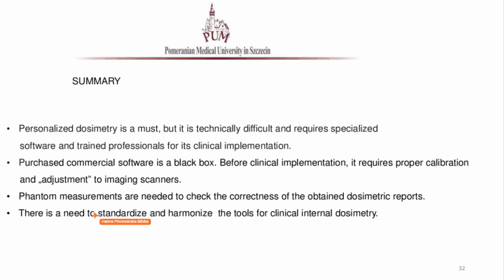Before clinical implementation, it requires proper calibration, proper understanding and adjustment to imaging scanners. Thirdly, phantom measurements are needed to verify the correctness of the obtained dosimetric reports. And finally, there is a need to standardize and harmonize the tools for clinical internal dosimetry.